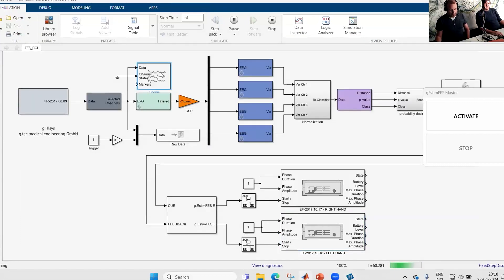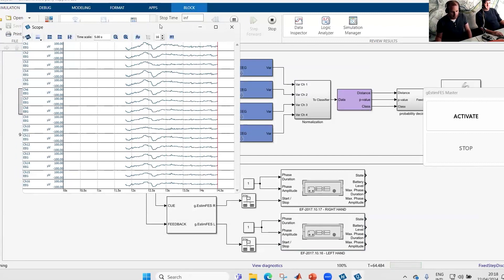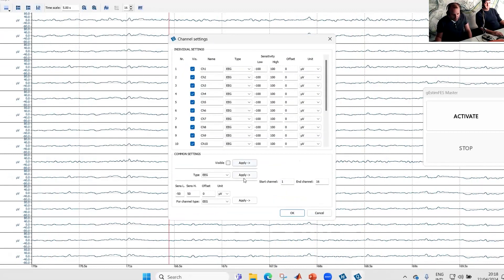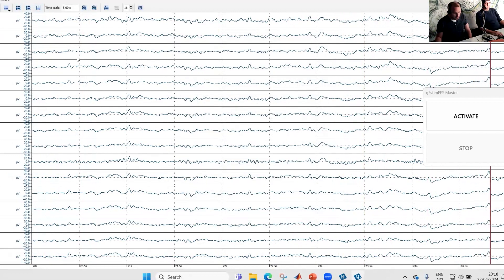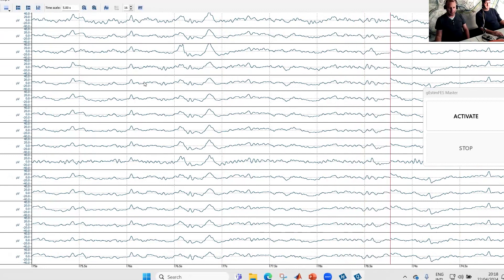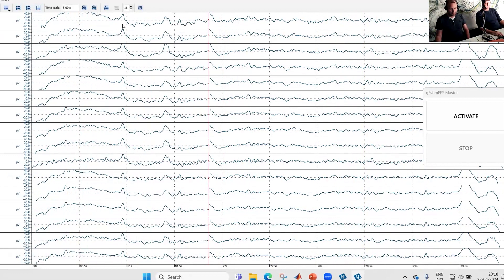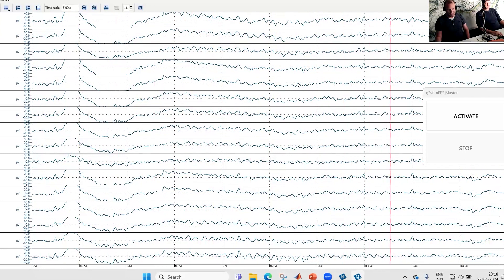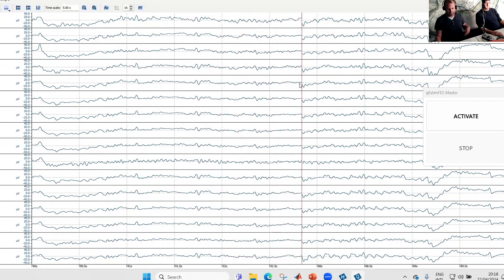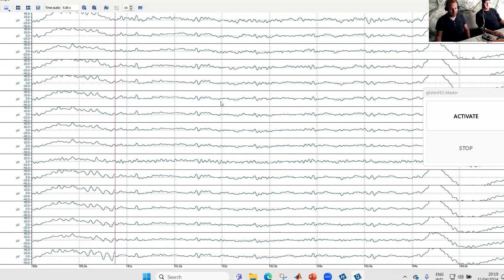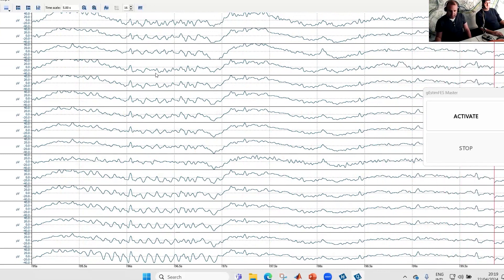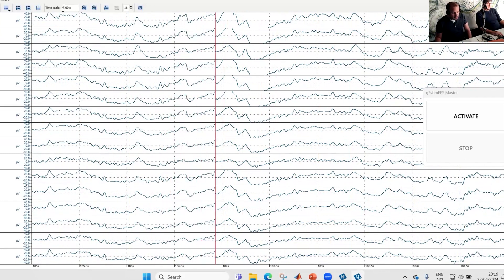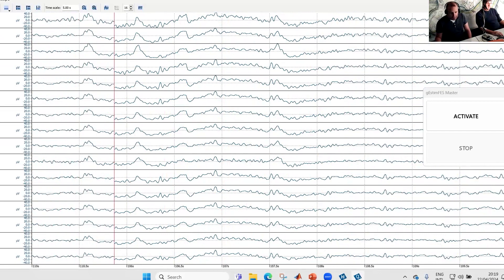First, we want to have a look at our EEG data. I open the G-scope here and we have our 16 channels. If Slobodan is making eye blinks, we see that here. When he's closing his eyes, we get some alpha activity. As my colleagues already showed today, always check if you really get good EEG signals — otherwise the experiment doesn't make sense. Our signal is good.